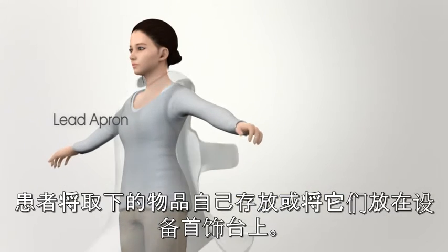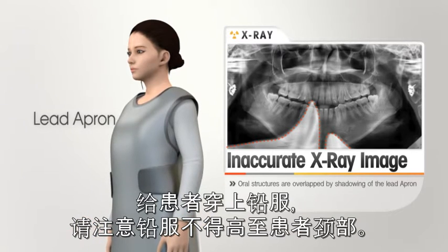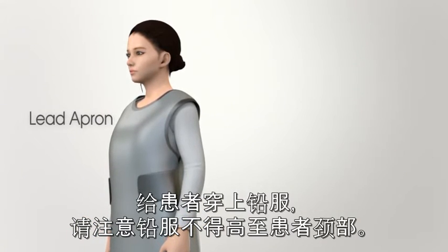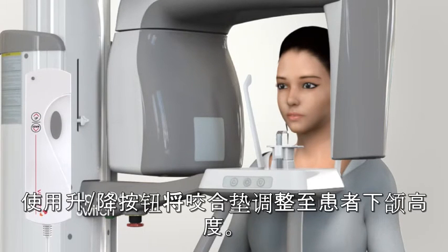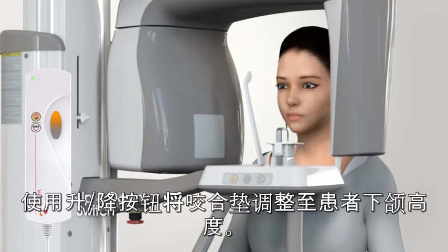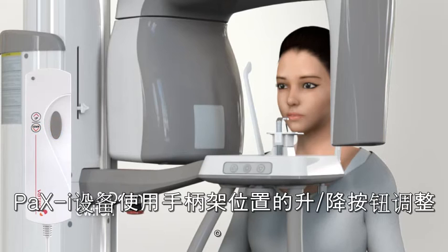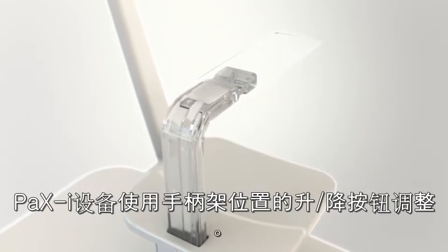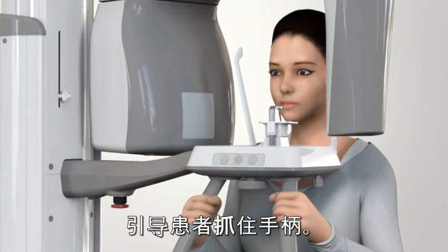Assist the patient to appropriately wear the lead apron. Be careful the lead apron is not above the patient's neck. Ask the patient to stand in front of the handle frame. Adjust the chin rest position approximately to the height of the patient's chin using the up-down switch. For PaX-i, the chin rest position can be adjusted using the up-down switch on the handle frame. Place a hygienic cover over the bite block and ask the patient to grasp the handle.